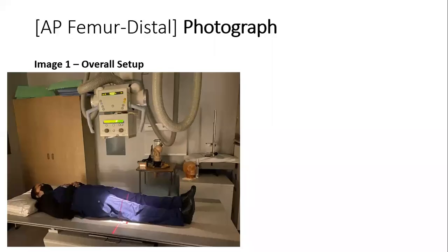Hello, today we're going to discuss how to position our patients for a distal AP femur. Let's begin. First, we will need our patient preparation.